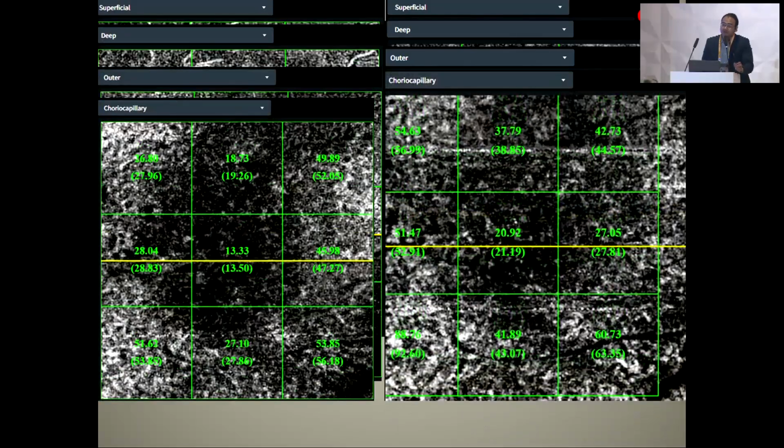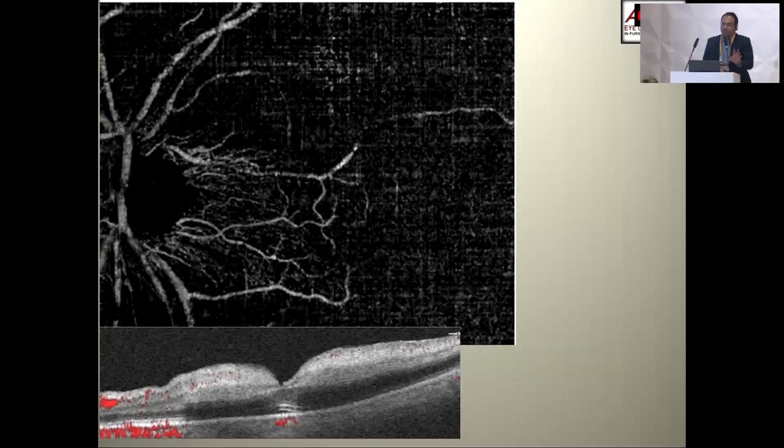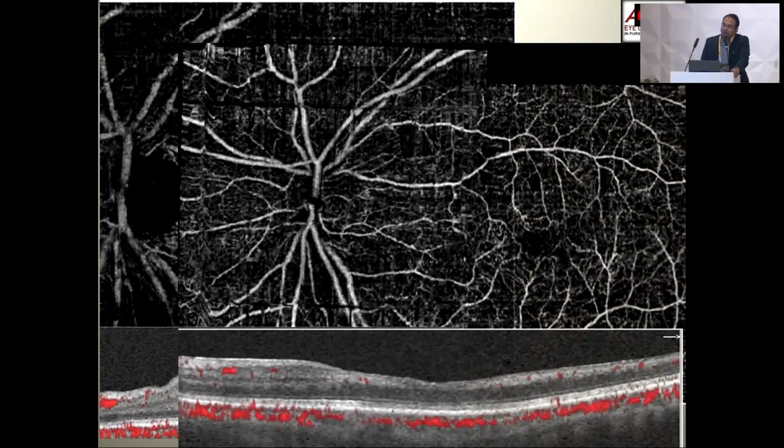This is helpful for yourself, and you can educate the patient also. See, the injection is showing effect. It is getting revascularized. This was a published case of a very rare thing, a triple cilioretinal artery sparing CRAO. See the amount of non-perfusion. The patient was sent for a cardiology workup and cardiology treatment. A stent was placed, and after that, see the beauty. It has revascularized, though the vision doesn't improve much. Why? Because this entire area goes atrophic, though revascularization and reperfusion happens.